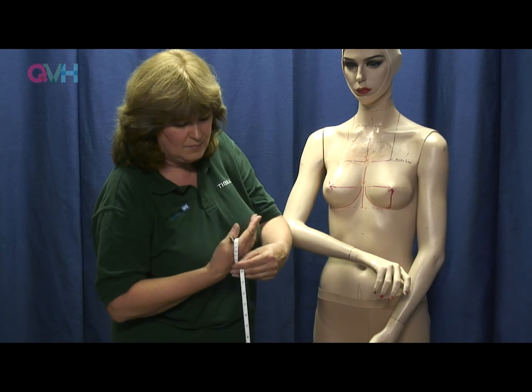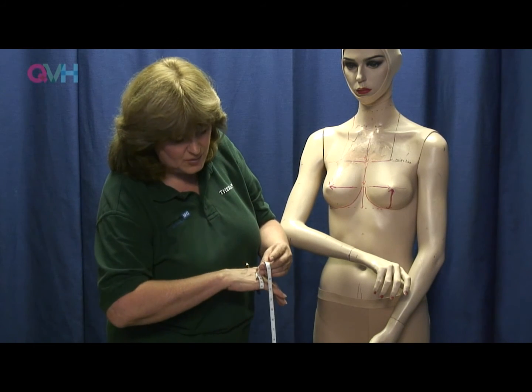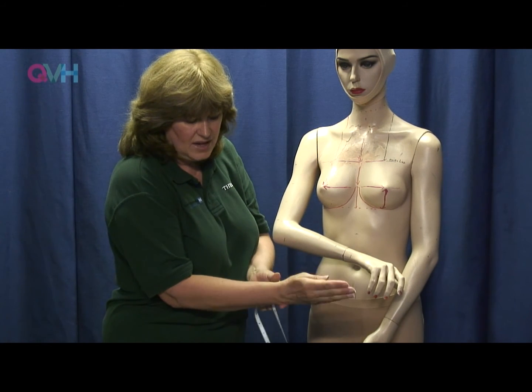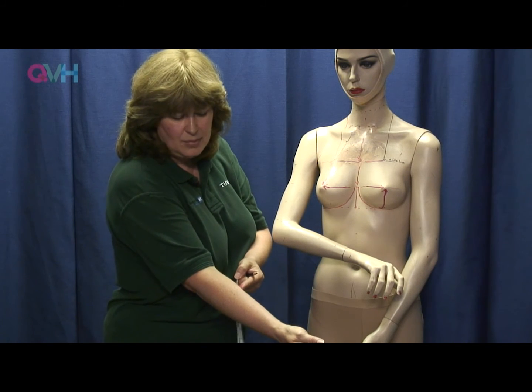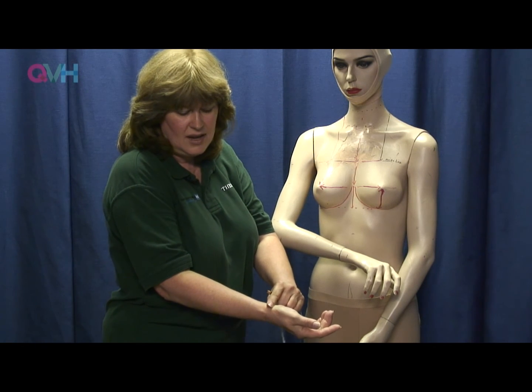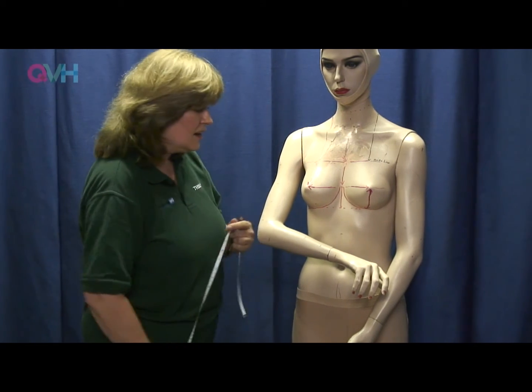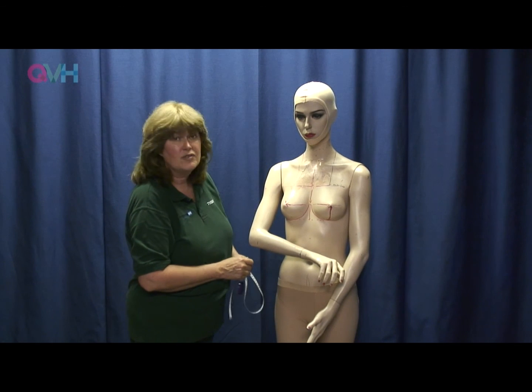so it's not the normal measurement you take for a glove, it would be that entire hand, which is 23, whereas without my thumb I probably measure about 20, but I have to take my thumb through that sleeve which goes back down to 14. It would have to open up with the zip so that the hand can travel through the sleeve and then be closed back down to be snug at the wrist in order to anchor the sleeve so it doesn't slide around and gives tension to whatever area of the injury you're treating.